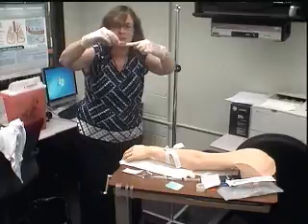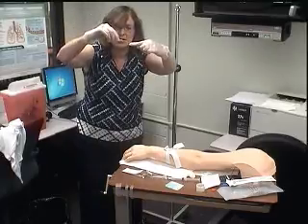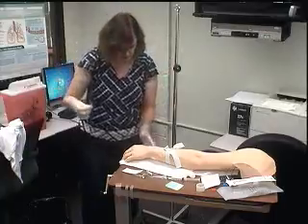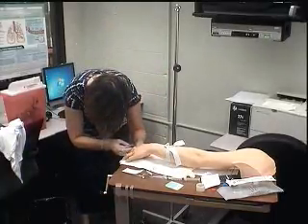And when I see it, then I'll drop it down a little bit. But I don't want to push all the way through. I don't want to be at 45. I'm talking about 15, boom, I'm in. Okay, so I'm going in, needle bevel up.